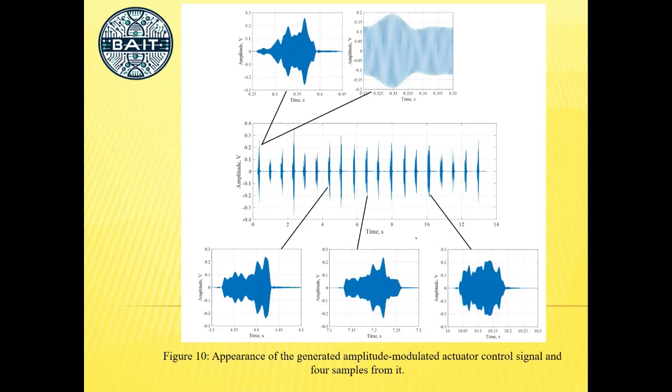In this case, the degree of mechanical deformation of the actuator will correspond to the parameters of the envelope component of the sensor signal, which will correspond to the dynamics of the latter's perception of external loads when touching or grasping objects. In the future, using such a system of tactile sensations, prosthesis users will be able to learn to feel the grasping of objects and differentiate their own sensations. The proposed design is simple and reliable and will have a negligible impact on the costs of the prosthesis, despite a significant expansion of its functionality.